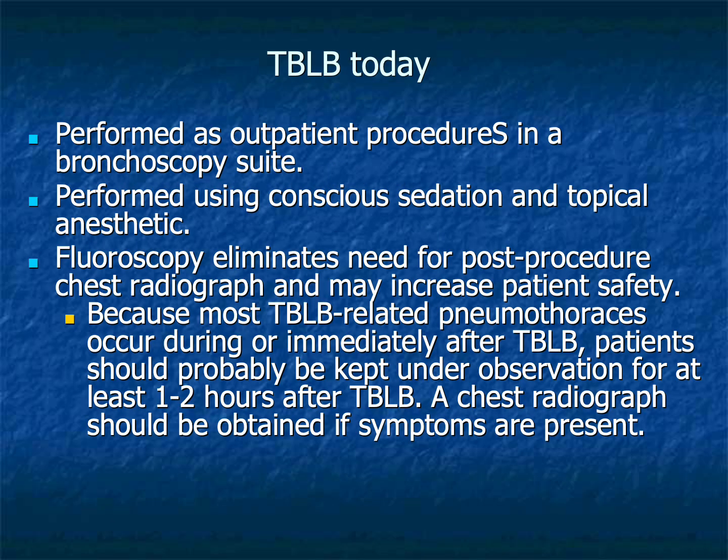Today, transbronchial lung biopsy is usually performed as an outpatient procedure in a dedicated bronchoscopy suite using conscious sedation and topical anesthesia. Fluoroscopy has become an important adjunct for many operators because it allows visualization of biopsy forceps relative to the pleural surface, facilitates accurate sampling, and often eliminates the need for routine post-procedure chest radiographs. Patients should nevertheless remain under observation following the procedure because pneumothorax, when it occurs, can develop during or shortly after biopsy.